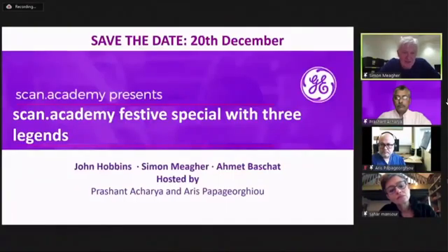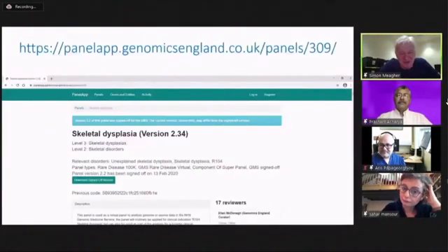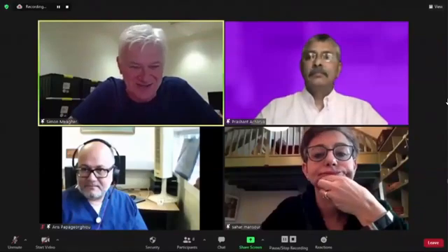I think I'll get killed by a radiologist if I don't say something towards MRI and skeletal dysplasias. But I think they do play a role with regard to the assessment of fetal lung volume and the constricted chest, and for assessment of the fetal brain with skeletal dysplasias. They can pick up minor fusions and appearances of long bones that we don't see in ultrasound. But I think there are enthusiasts for it in the world, but I wouldn't say it's routine.